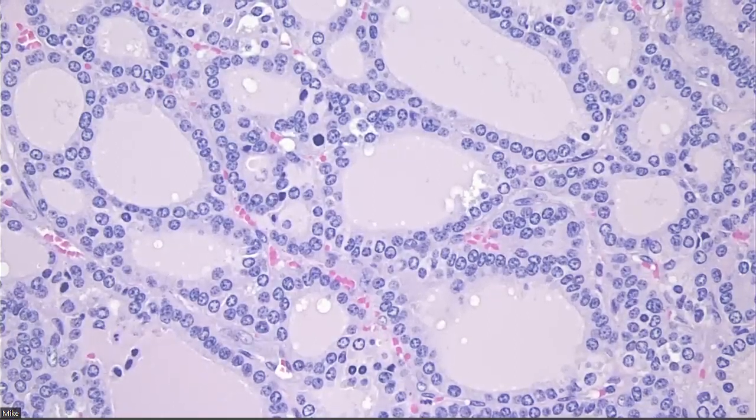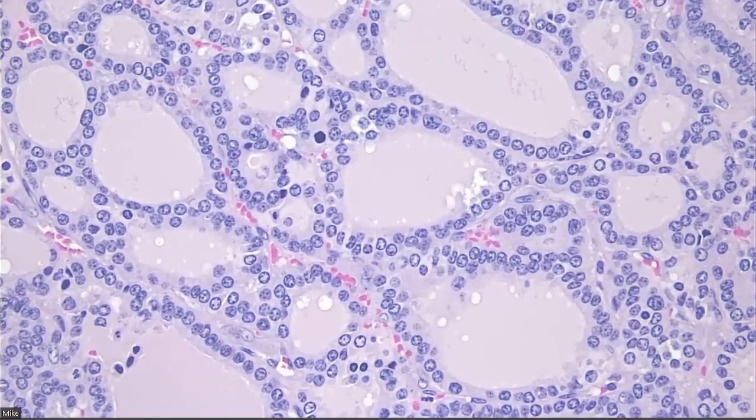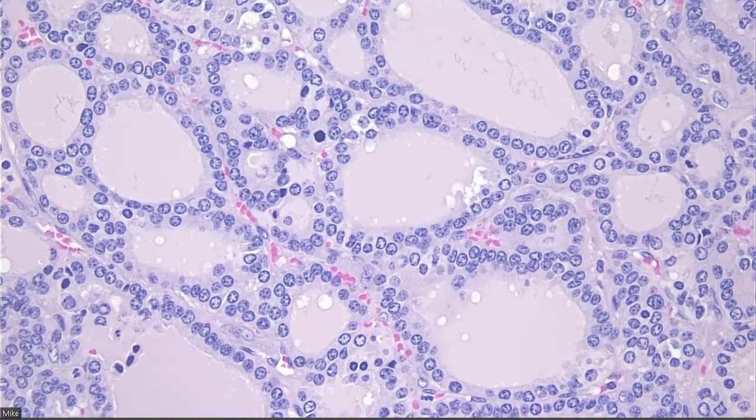The validation criteria for each of these studies: for the poorly diff, for the Turin, they want 3 mitoses. For the high grade diff, they want 5 per essentially 10 high power fields. Some have argued, well, should we make both the same? Should we make both 3? Should we make both 5? I don't know what's going to happen, but just at least have it in your brain that maybe something can be high grade, even if it doesn't have solid growth.